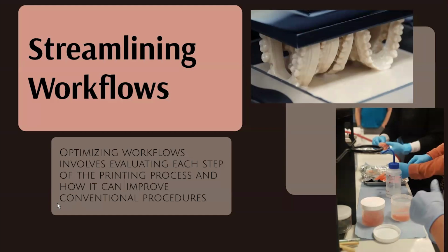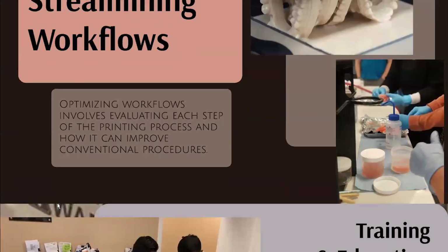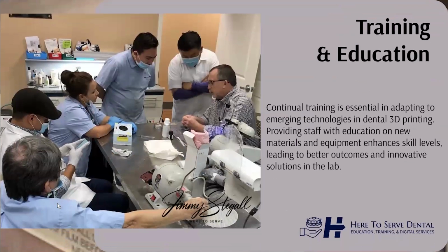I mean, think about it. If I get an intraoral scan for a 3-unit bridge, I throw that directly into the printer, run the model software, build it, and print it, instead of waiting on stone to set up, instead of mixing and all the mess associated with that. So it makes our capacity much better. Plus, I'm going to talk about AI here in a minute. It makes it even faster.